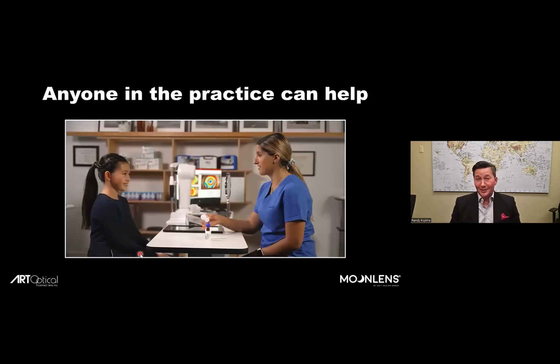Now, one thing that I think might be apparent from this talk is you have the ability to have your technician do much of the work. The technician can take the topographies. The technician can upload the maps. They can order the final custom lenses for your patient. So ortho-k can be even more efficient because you can use your technicians rather than you needing to be involved in this entire process.